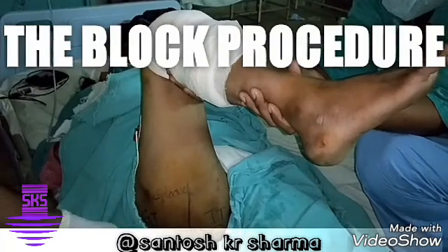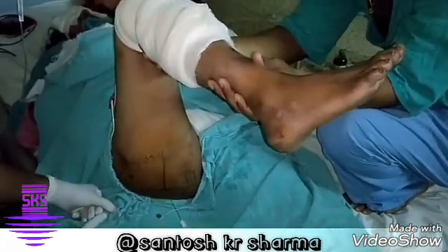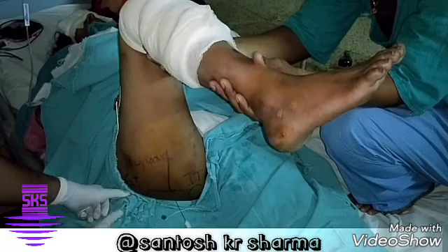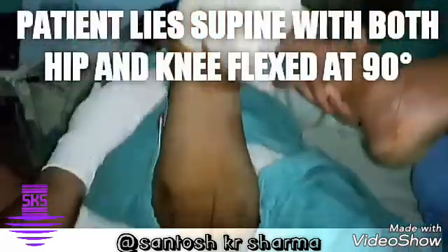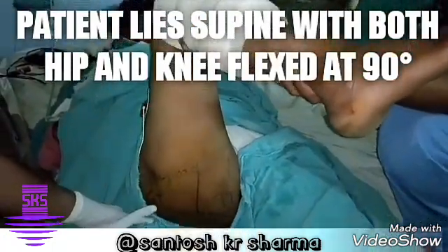This is a case of tibial plateau fracture and we have planned a femoral as well as sciatic block. This is for analgesia purposes only. Initially we are giving a sciatic block and the approach is the lithotomy position where the hip has been flexed and knee has been flexed both at 90 degrees.